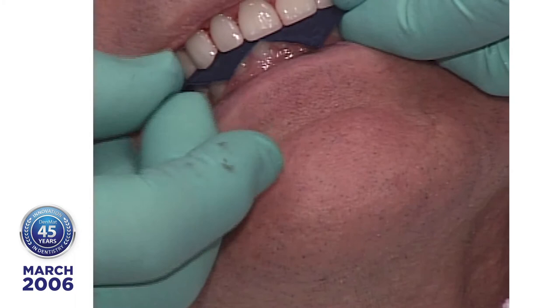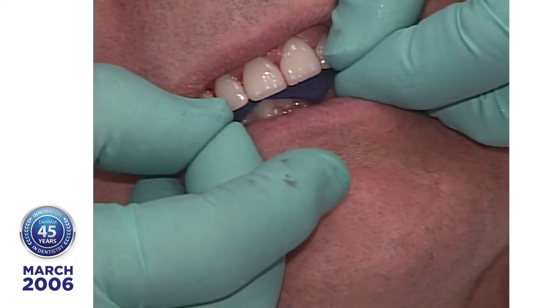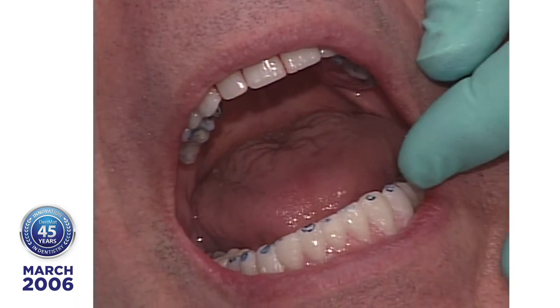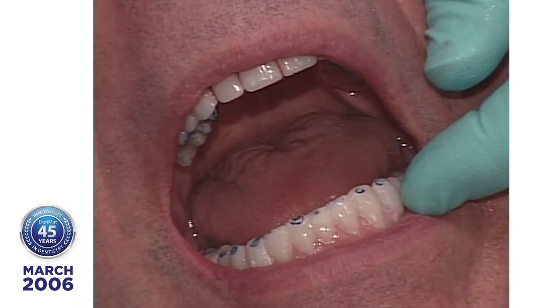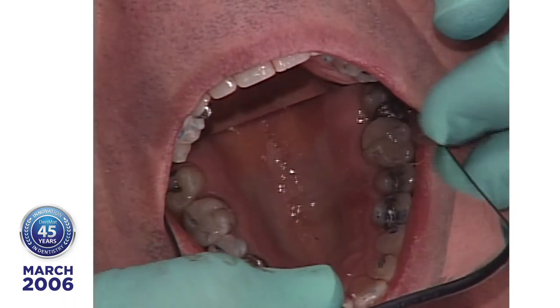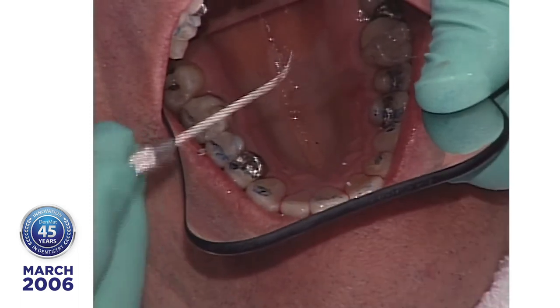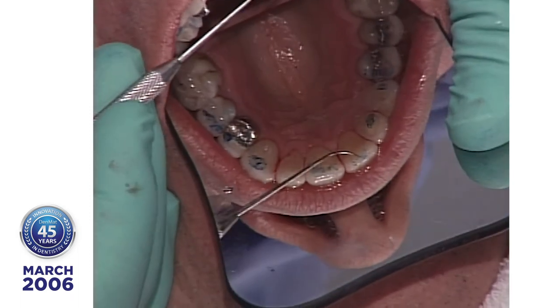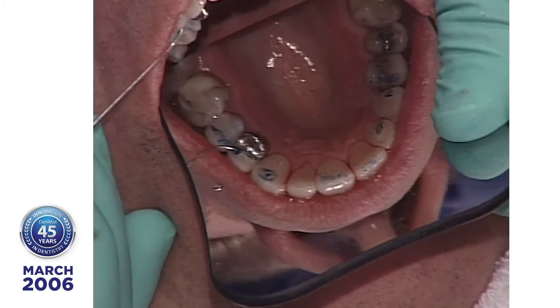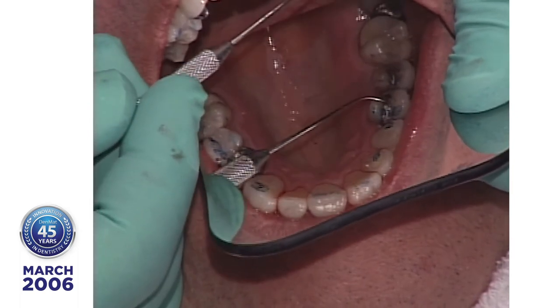Close. Gently grind your teeth around. Go forward and back, sideways. Okay, open. Now let's see what we have. Okay, now we're getting it. And so we want to get it so that, let's see what the maxillary looks like. Couple of spots, explorer. Okay. And we want to make sure we don't hit heavy on these areas right here. But so far, we're looking relatively good.